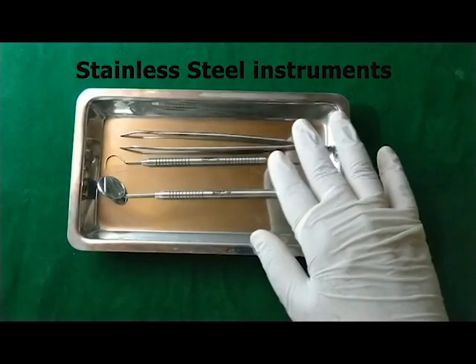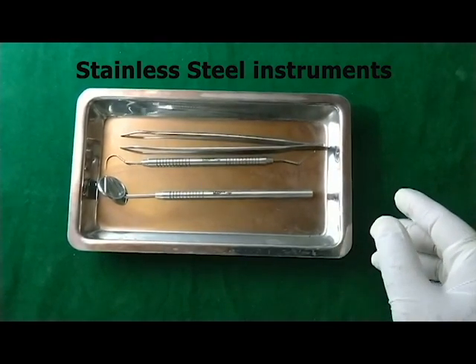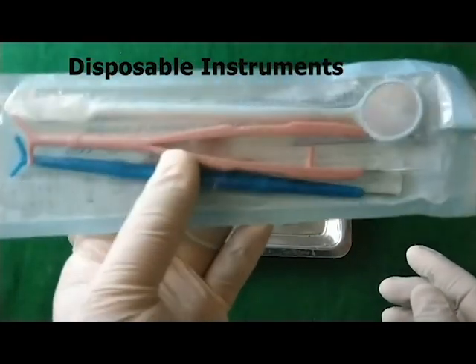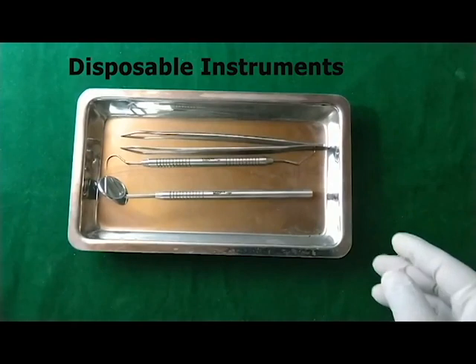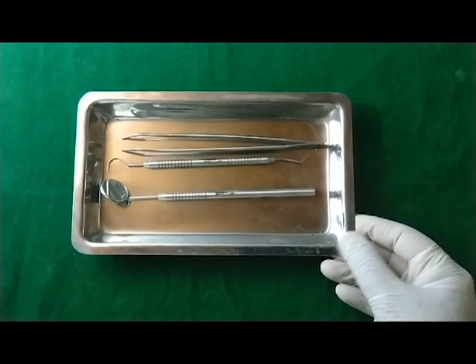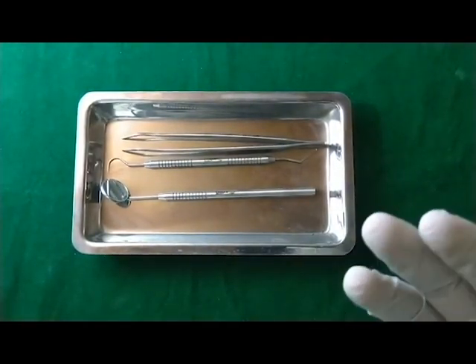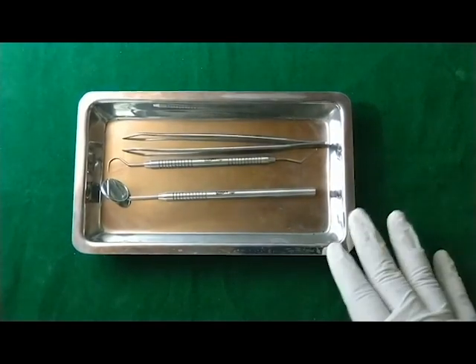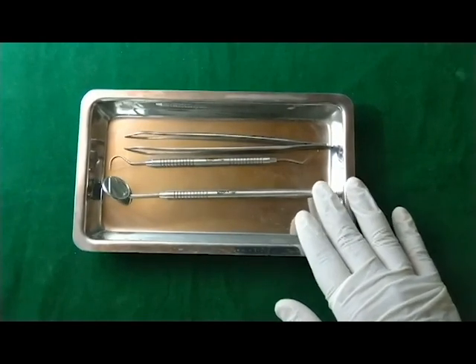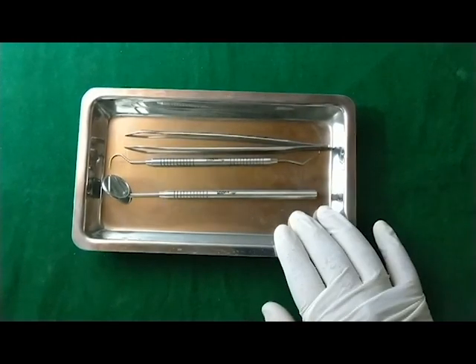Regarding fabrication material, all these instruments are made up of stainless steel. Alternatively, there are instruments made up of plastic, also known as disposable instruments. These stainless steel instruments have certain advantages — for example, they can be reused again and again after proper sterilization and disinfection, so they are cost effective. But at the same time, there is a chance of cross-infection if proper protocols of sterilization and disinfection are not followed.